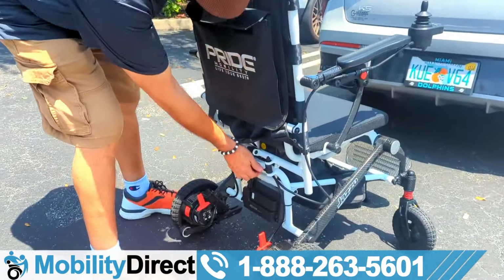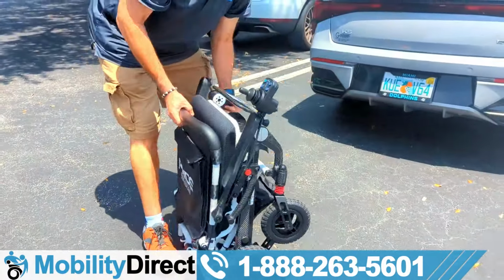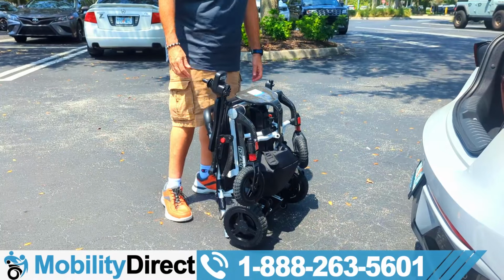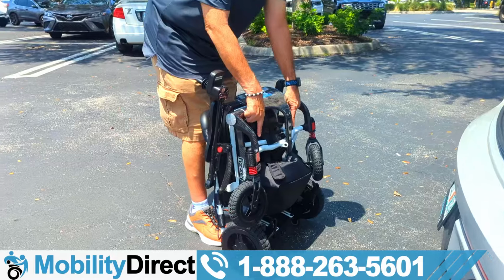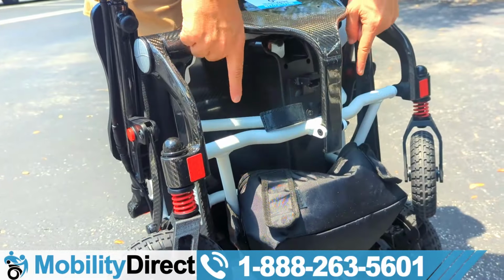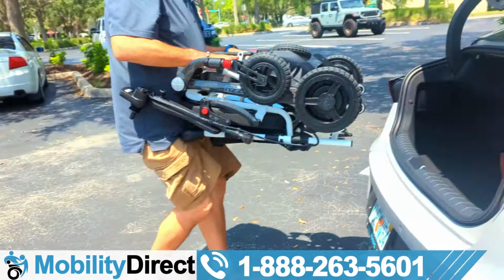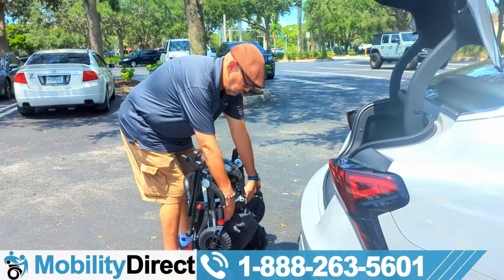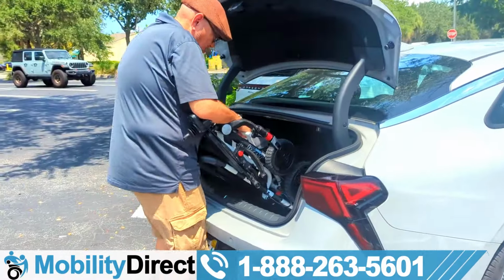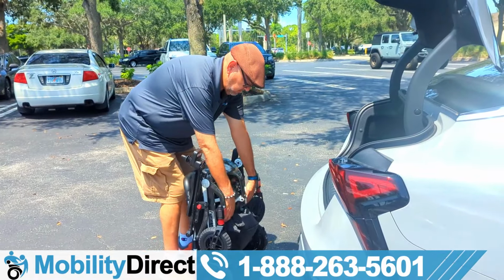So when you fold it, you're going to be able to tilt it up and stand it up on its back side. That's the design. It's able to stand up on its own. And when you're by the trunk of your car, you're going to grab the two handles that we're pointing out here, part of the frame, and you're going to push towards you so that the seat is leaning up against your hip and you're using leverage to kind of tilt back. Here's another shot. Tilt back, push it up against your hip, and then just slide it right into the trunk. I promise you it's going to be a heck of a lot easier to do it that way.